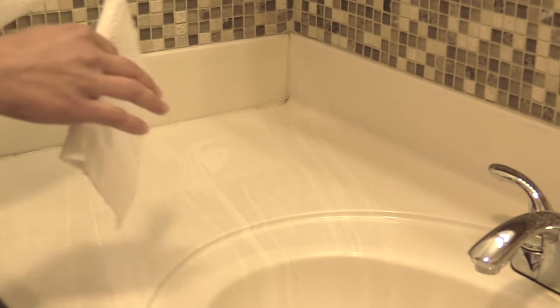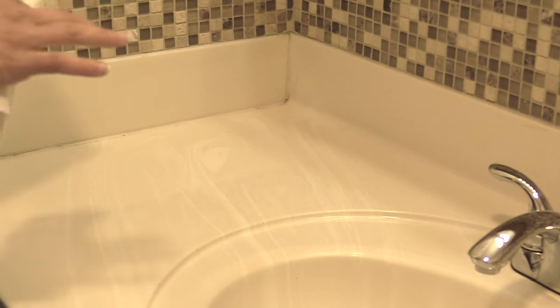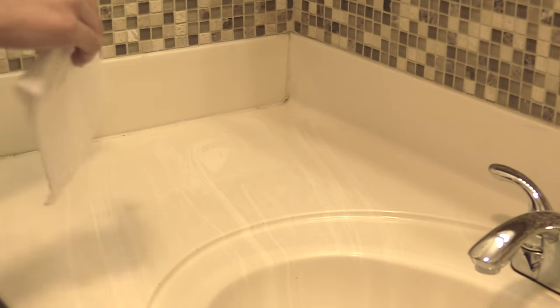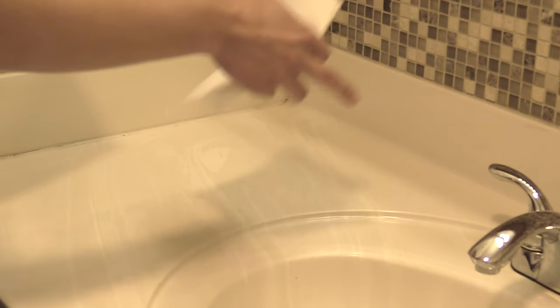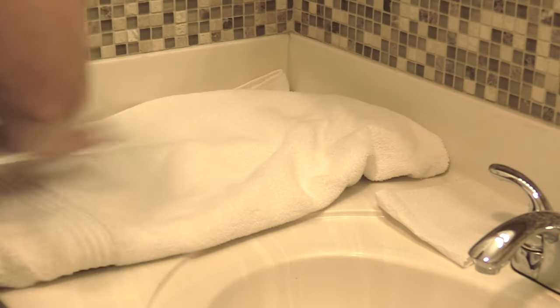First, what I like to do is prep my sink area because I don't want any of my supplies to become contaminated. Since we're going to be turning the faucet on an awful lot, we're going to put some extra paper towels there so we can use the towel to turn it on and off without contaminating our gloves. Then we're going to lay down a towel in this area to help protect our supplies — just lay it down nice and neat.